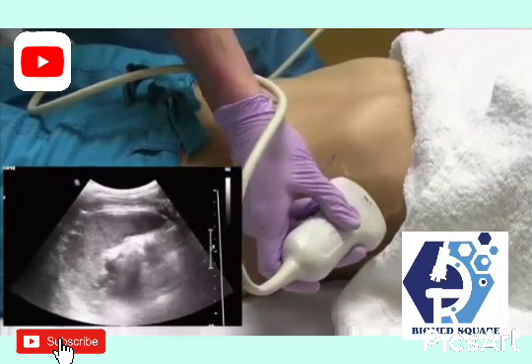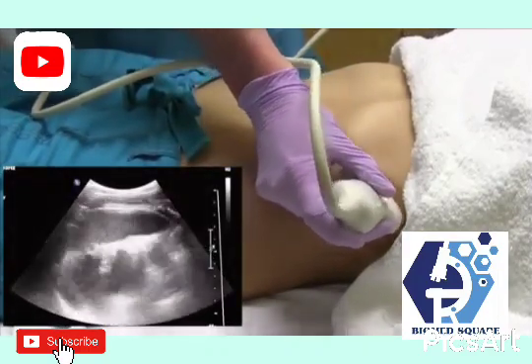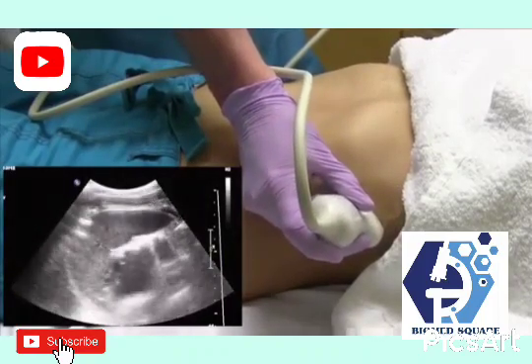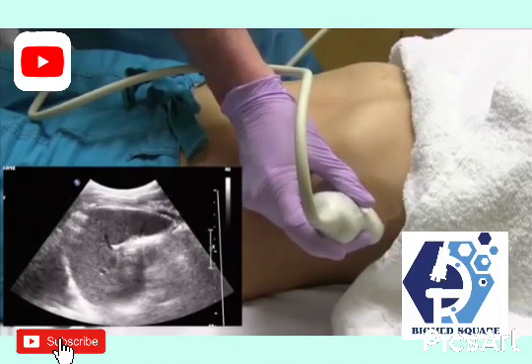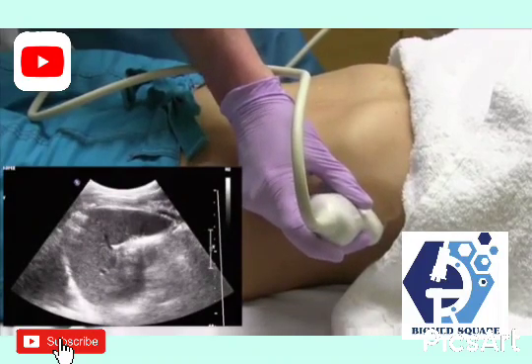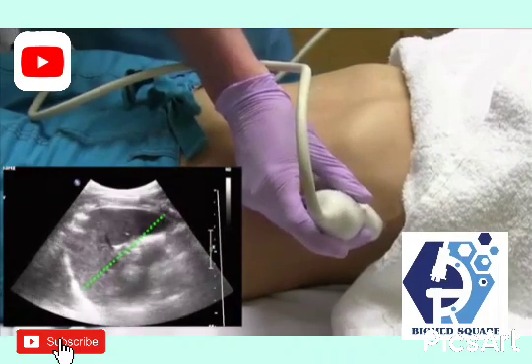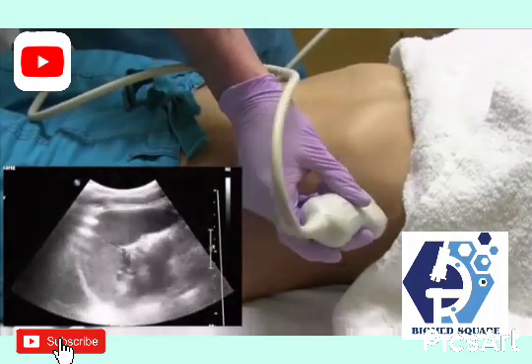And from here, you just want to make sure you're sweeping through that entire rib space. For the spleen, once you get to the maximal dimension of the spleen, we usually measure the length of the spleen in this window here. And you sweep through the spleen completely in sagittal.